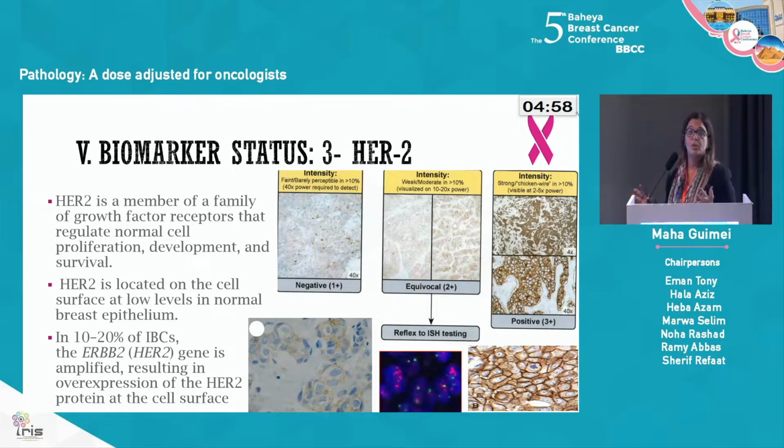لو إحنا في النص اللي هو ما بين ده وده، intermediate staining، يبقى this is the +2، this is the equivocal category، اللي الإميونوهيستوكيمستري هنا مش مساعداني، محتاجة resort to more sophisticated techniques، أعمل له FISH أعمل له SISH according to the lab that you are dealing with بيعملوا إيه. Now في بهية we do SISH and it's very very well done في بهية.